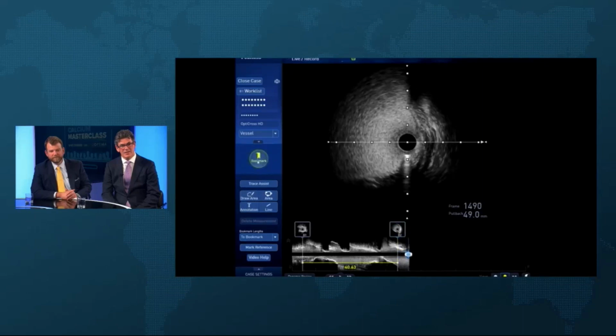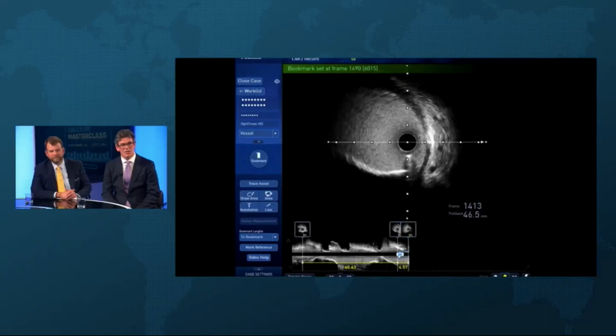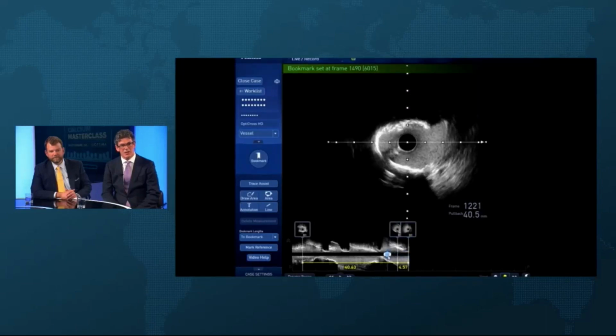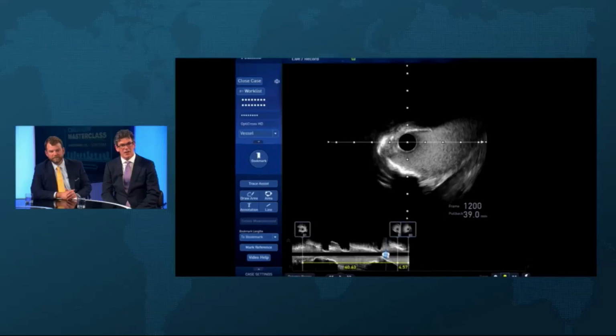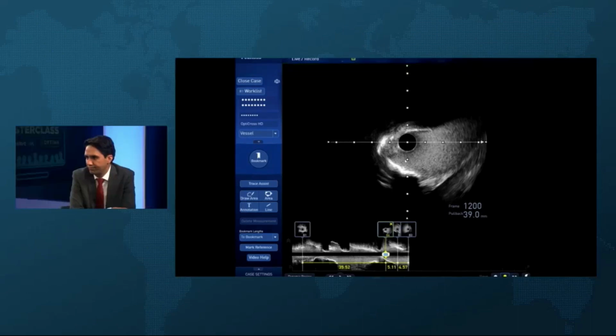Well, you move the distal end in a bit. Maybe you'll get, you've got loads of space there, haven't you? Keep going, keep going. There's the circ there. I mean, there is distal left main, isn't there? I would use a 6 millimeter balloon if you have it for the pot here and be good. Yeah, we do.